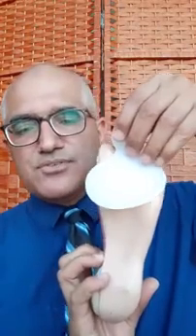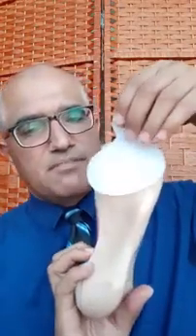This is very useful. And in other cases, we also use this silicone pad, and the toe goes inside this ring, and it pulls it down. So it also makes the toe straight. At the same time, it also supports the head of the toes, so it also reduces the metatarsal pain, the forefoot pain in the patient.